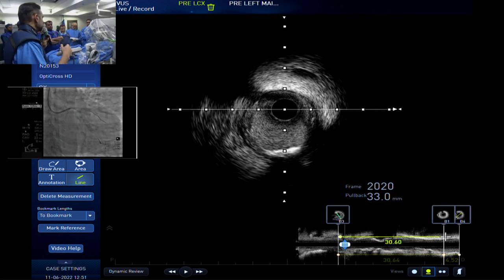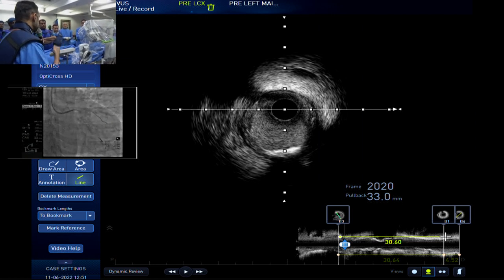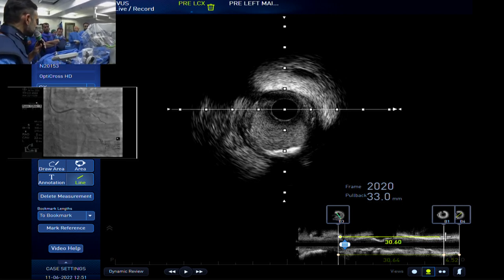And if you wanted to be strict to the protocol, you'd put a physiologic wire down at the end to prove that your physiology is normal, and you do a brief echo at the end to make sure there's no effusion. Then you're true zero. But here, I'm sure if you took one 3cc picture, nobody would be upset.